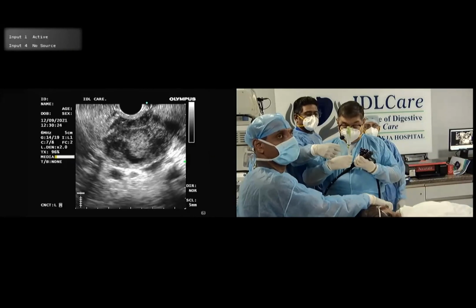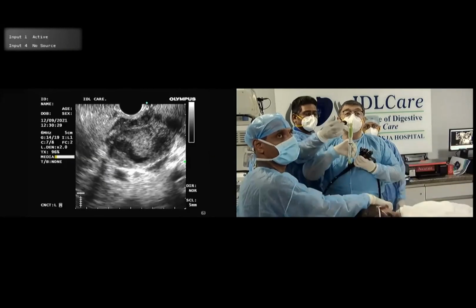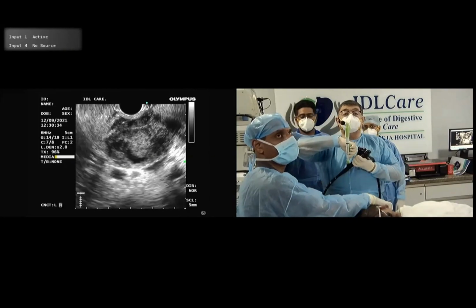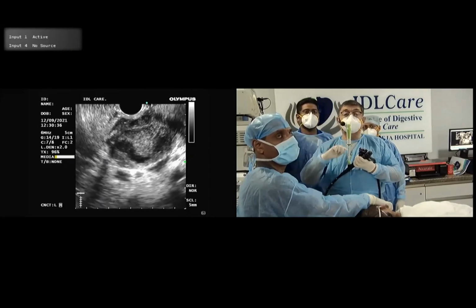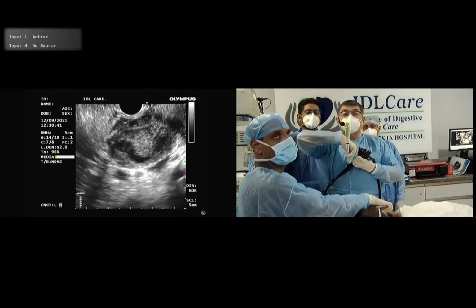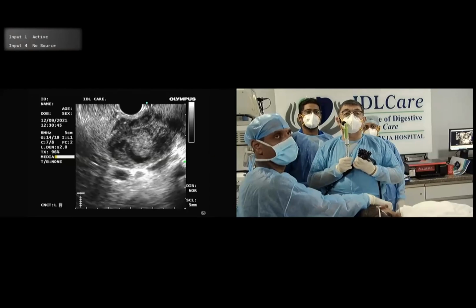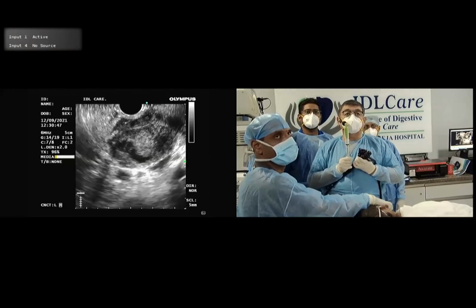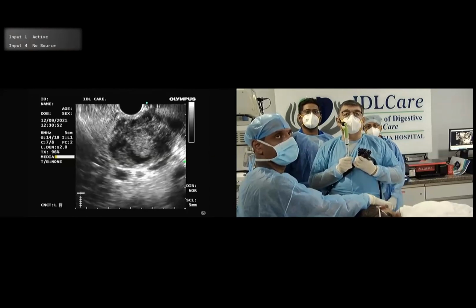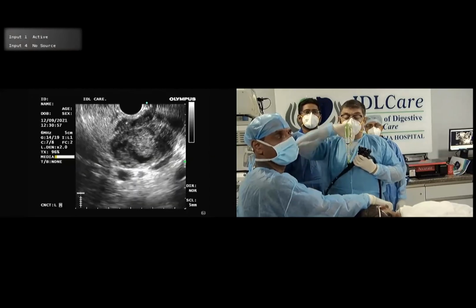So yesterday, Rajesh and Jahangir beautifully showed you the biopsy. What we do is, if you can see here, as was explained yesterday, there are two buttons. First, we use the lock for the sheath. We open the sheath, push it a little forward till it is seen on your ultrasound. Not too much. You see here, you can see the sheath now. See that it is moving at the top of your ultrasound screen.